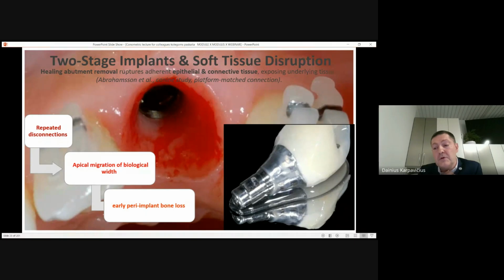And for today, unfortunately, we have quite a big percentage of peri-implantitis from these solutions that we made in the past. I hope for today we know new rules, new methods, and I hope that we will escape this nightmare, because peri-implantitis is a nightmare for us and a nightmare for our patients.